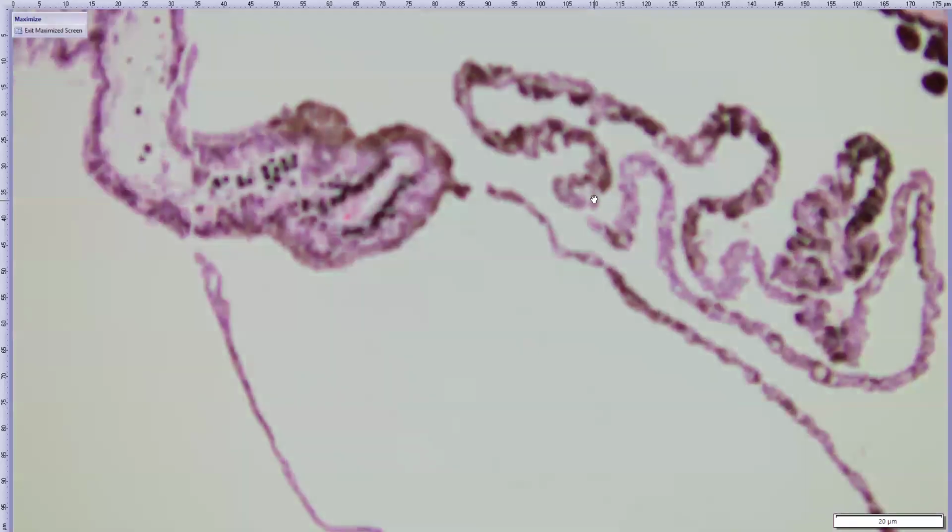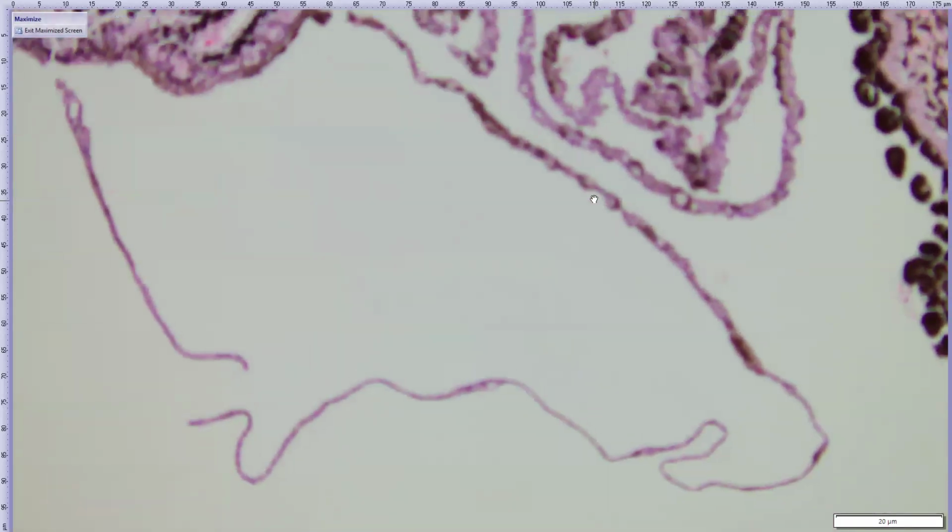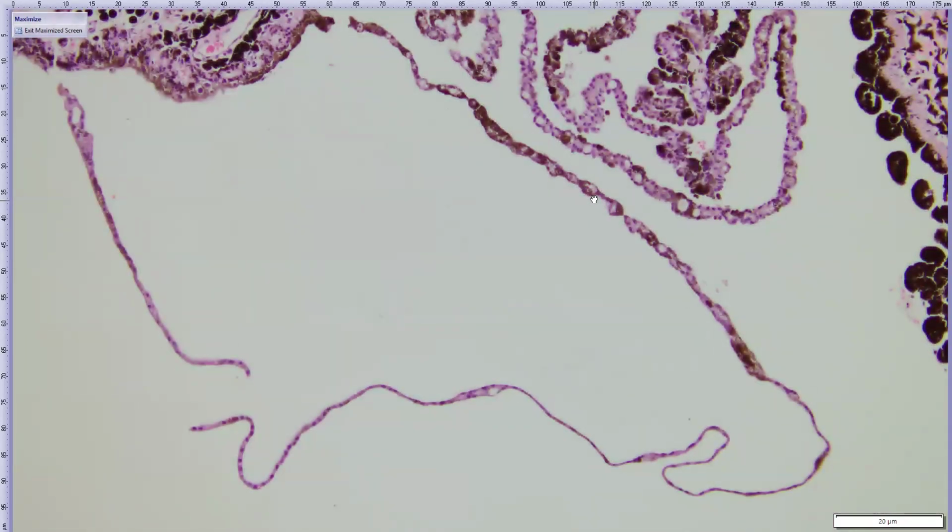Fun little bonus. Iridociliary cysts. Just like the other eye they described clinically, these ones probably weren't visible through the front of the eye anymore, but here they are. They're probably clinically incidental for this patient.